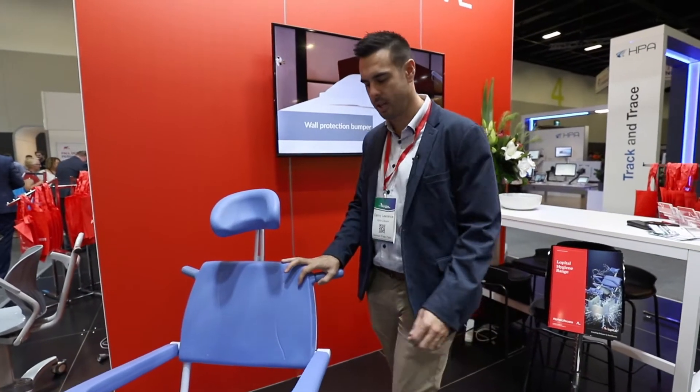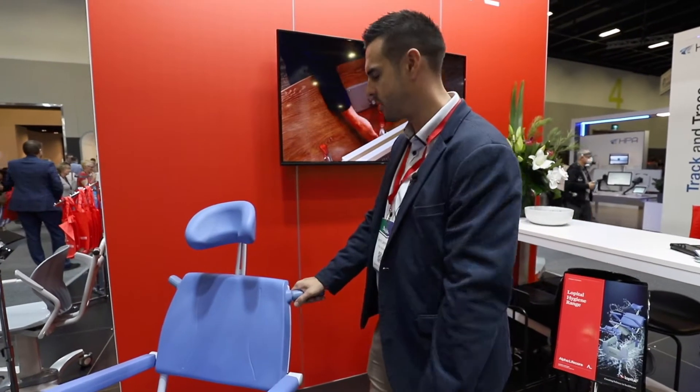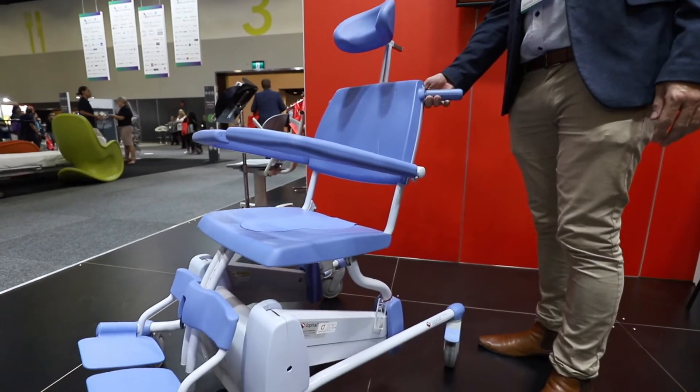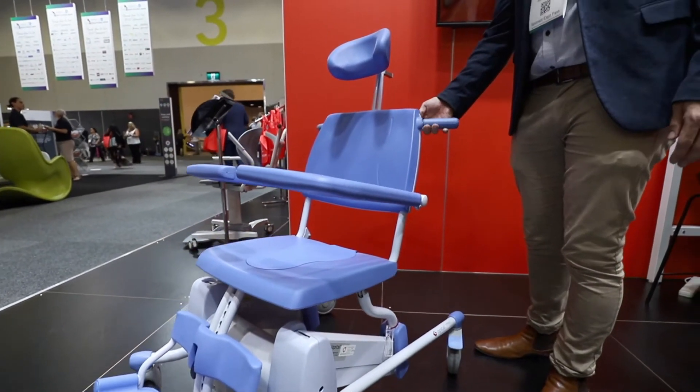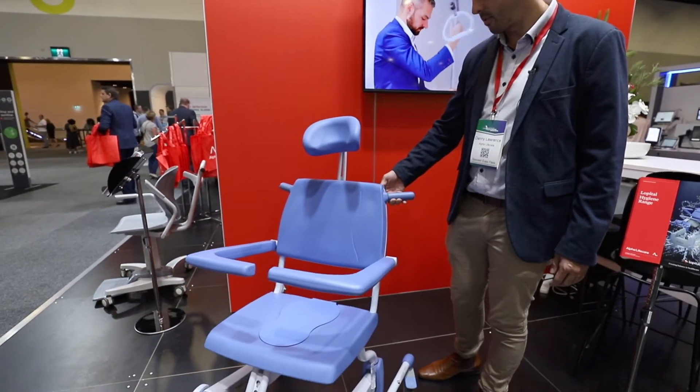This particular chair is an electric recliner model that has a tilt function and also a raise and lower function. So it can go quite a way down to the ground for shorter residents, and it can go right up and tilt right back for great access to the resident.